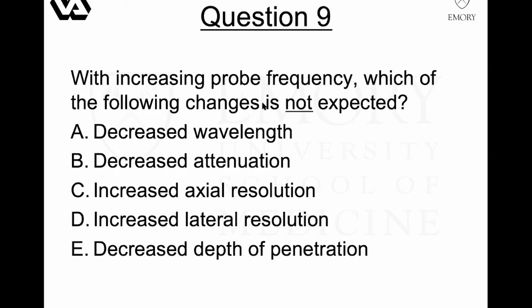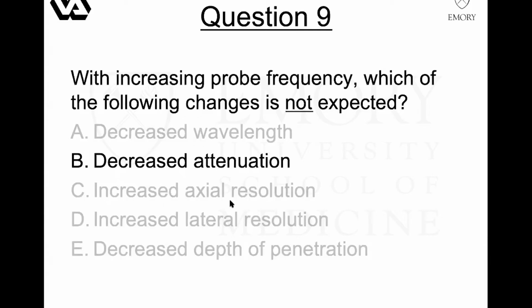So, as you know, wavelength and frequency are related. As frequency goes up, the wavelength has to go down. So A is definitely expected. Okay. C, axial resolution is actually related to the frequency. The higher frequency actually produces better axial resolution.